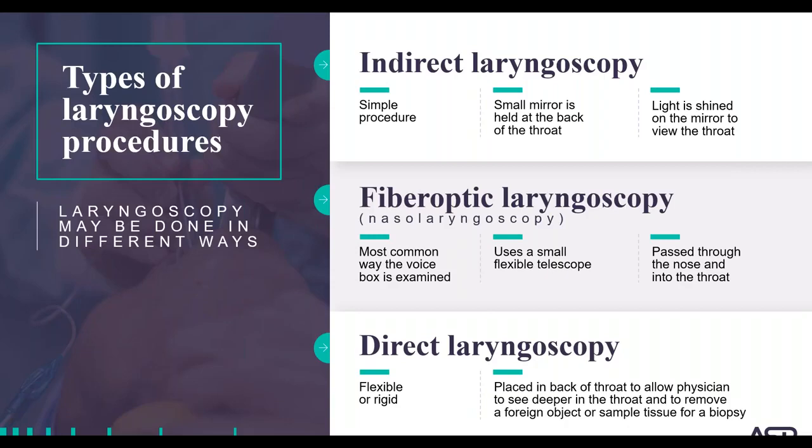An indirect laryngoscopy is the simplest procedure. So I want you all to think back to when you were a child and visiting the doctor. One of the assessments the doctor likely performed was to place a tongue blade, hold down your tongue, have you say ah, and then inspected the back of your throat.